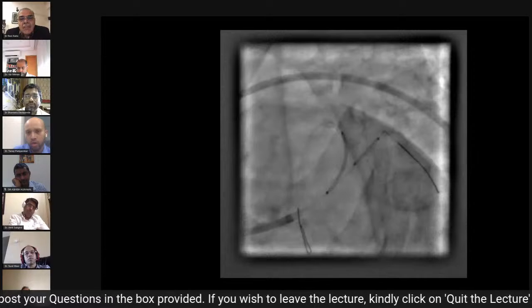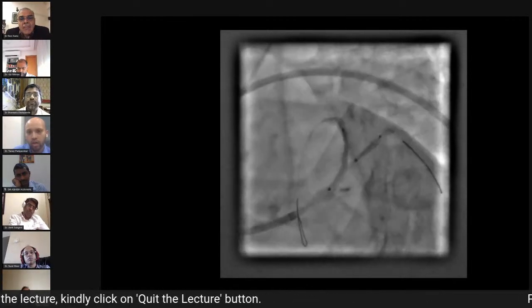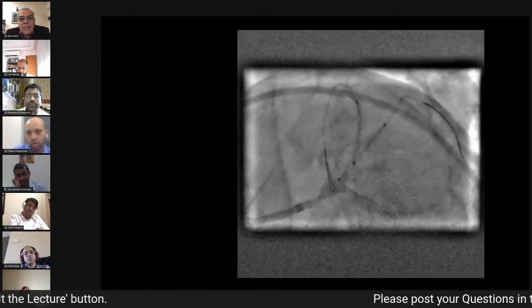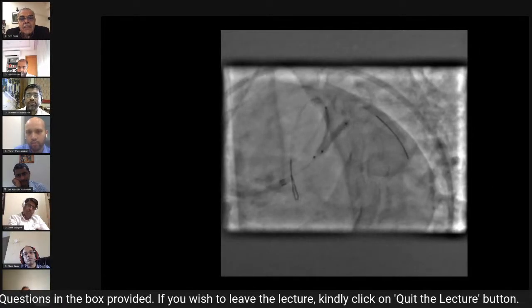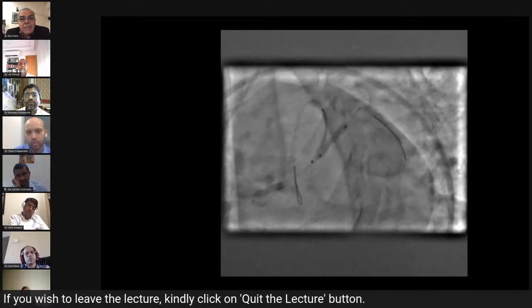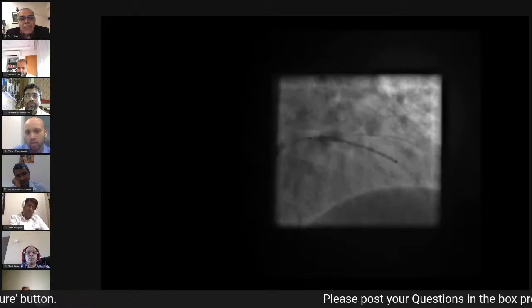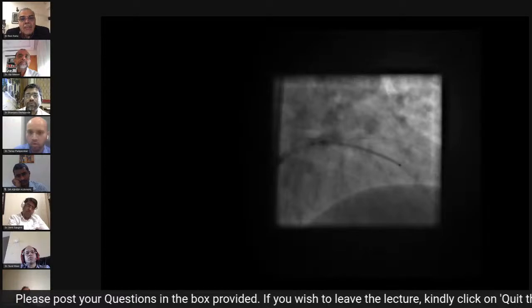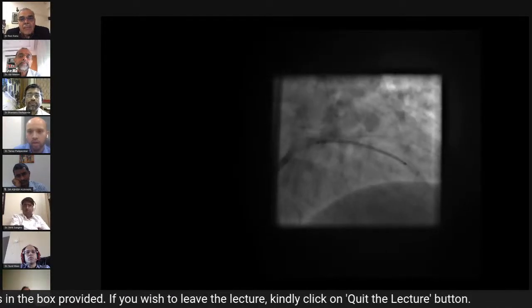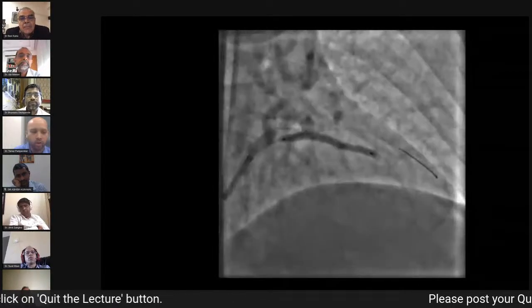Finally, two stents were used, as we can see here in the diagonal and also in the LAD. The diagonal stent was pulled back and positioned with almost 2 or 3 struts into the LAD, and the diagonal stent was then deployed. The balloon in the diagonal was removed. For the LAD stent, I made sure that it had overlapped with the distal stent. There was a stent boost image, which I have not included here. After that, the LAD stent was also deployed. The proximal one is a 2.75 by 32 millimeter stent.